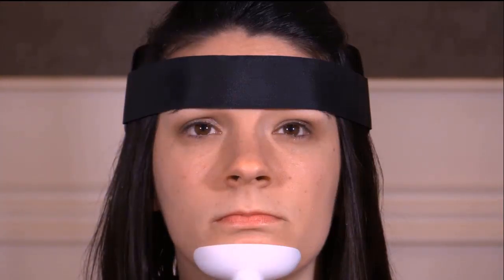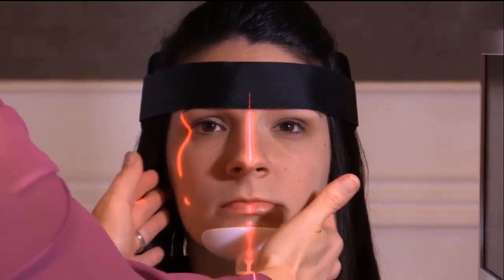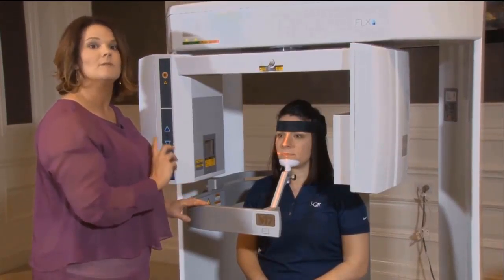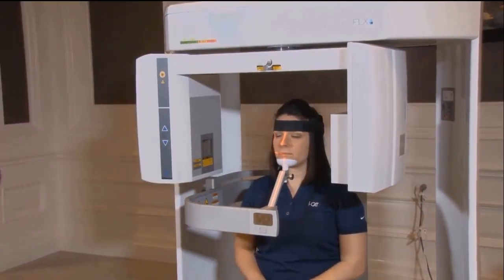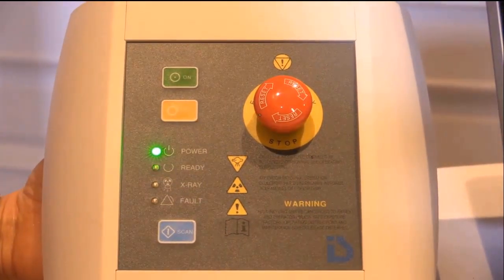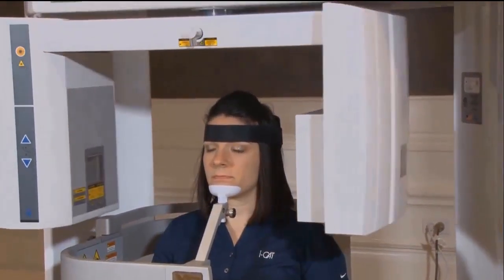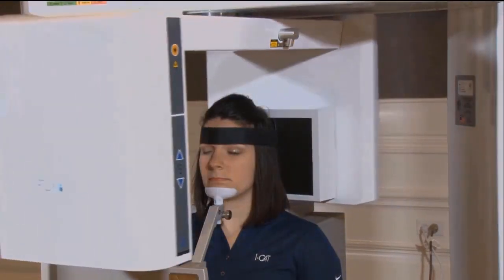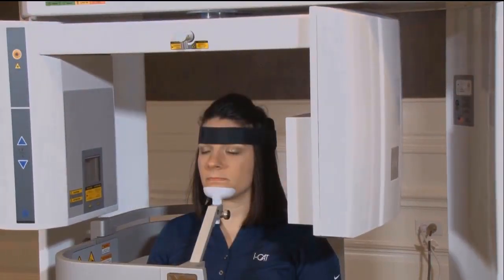Now we're going to go ahead and take our image. I'm going to double check my alignment, then let my patient know to take one final swallow, bite down on your back teeth, and place your tongue right behind your front teeth. I also want to let my patient know that the machine is going to rotate around, so if they feel like they're not going to be able to stay still, I'll have them close their eyes.